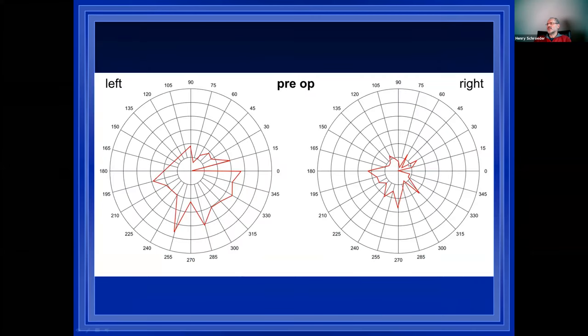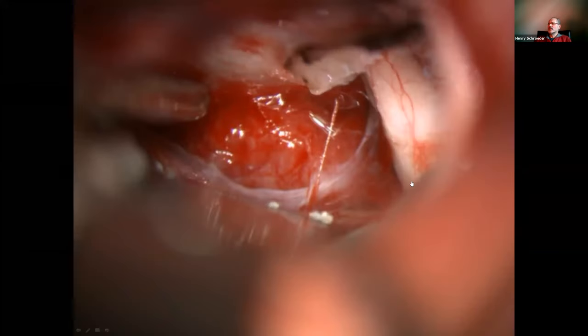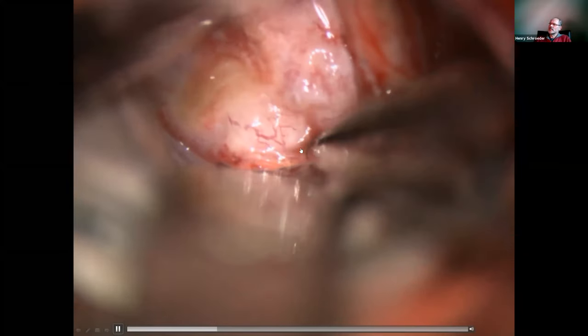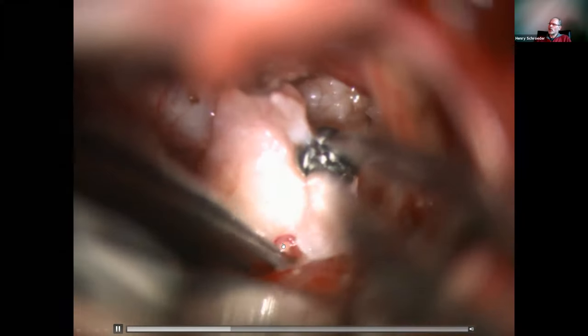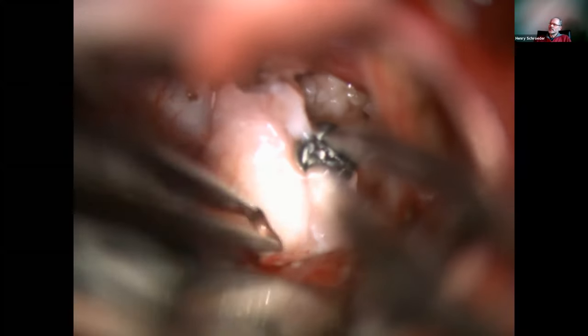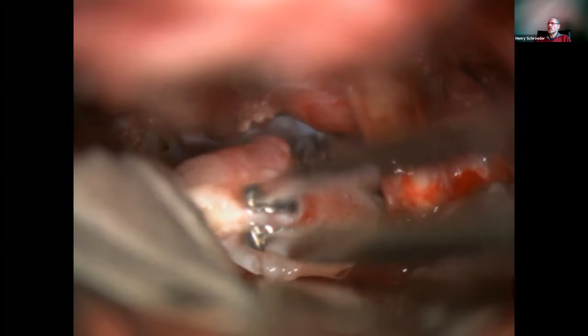You see the ophthalmological findings were very poor, visual acuity was not good, and you see it's really a tunnel view. This is the opening, so we cut the first step, the falciform ligament. We open the canal if the tumor is extending into the canal, but in this case it was not. So we cut the tumor, it was very fibrous, CUSA was not working. This is a crucial step now. You see you have to dissect the arachnoid plane and preserve all the small vessels which supply the optic apparatus. All branches from the superior hypophyseal artery complex should be preserved, and the tumor is taken out.